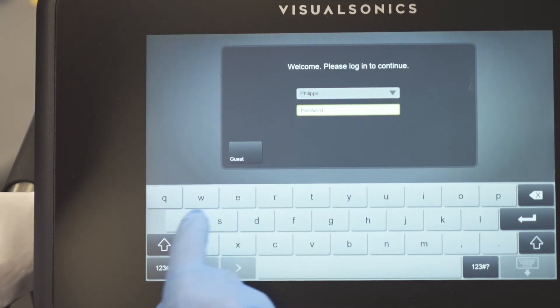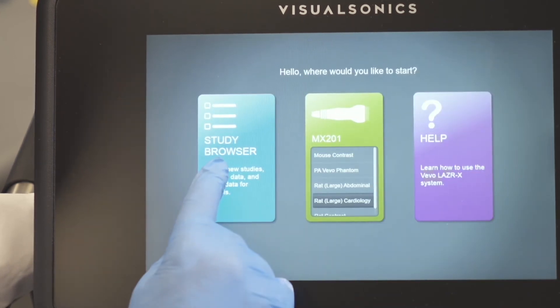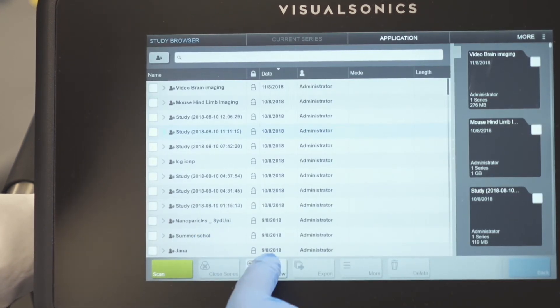Each user can have their own account with their personal settings. The touchscreen user-friendly interface makes it very easy to navigate through the system, just like your smartphone.